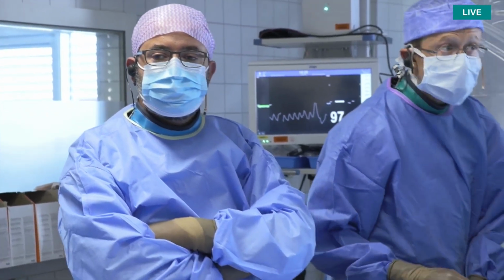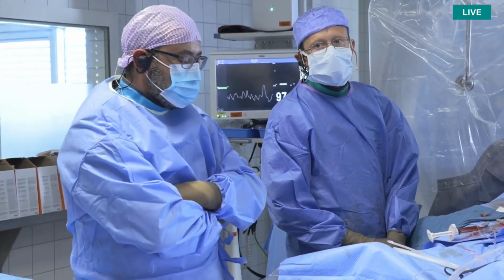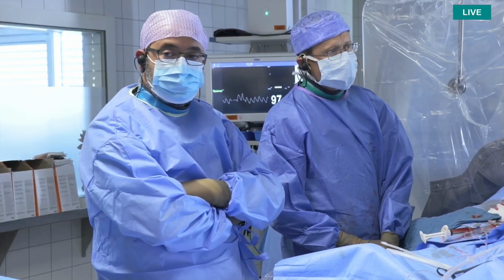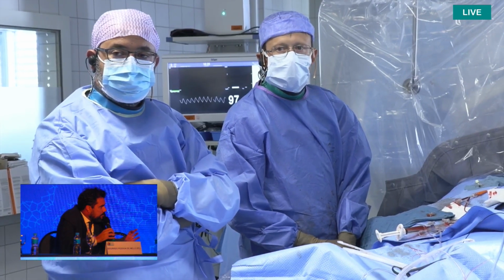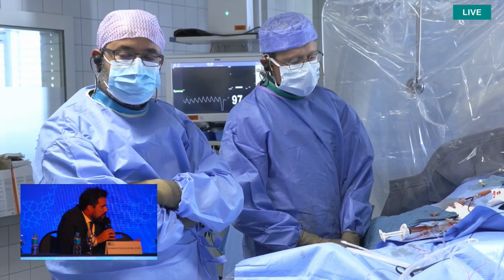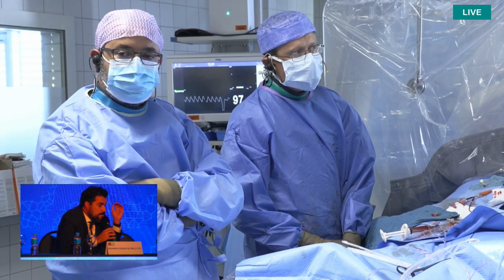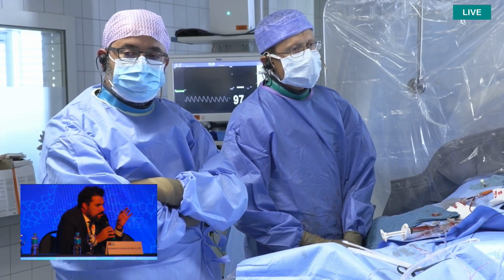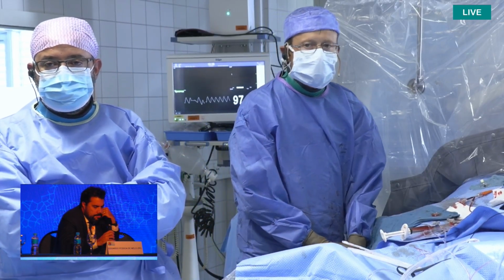Any comments about the panel? Eduardo, your strategy for this case? Thanks, Fábio. It was a very difficult case, but so interesting. I believe, first of all, we have to predilate something. Then I would interrogate the lesion before with IVUS and then rotablation. But it's not possible in some cases, because sometimes you can't cross the lesion with the IVUS. But if possible, I would interrogate before rotablation and then define the final decision.